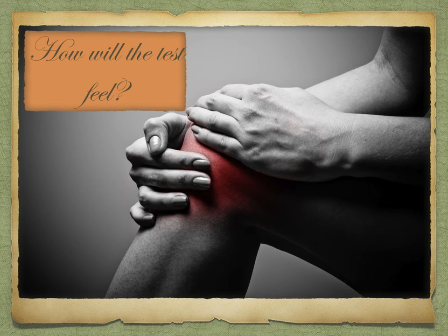As the needle is inserted into the patients, they may feel slight pain. However, during the test, no pain is felt. As the testing is going on, the patient must remain still, as they will be instructed when to change positions by the technologist. Because the patient will be still for a very long period of time, they may feel uncomfortable or discomfort.